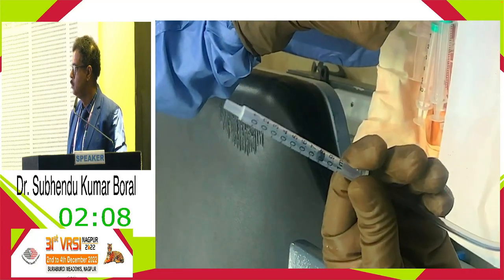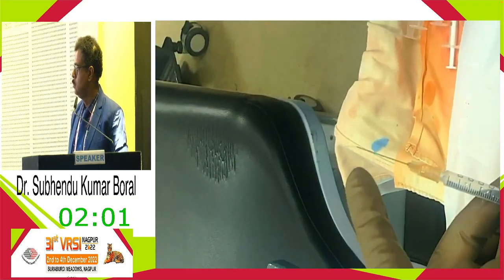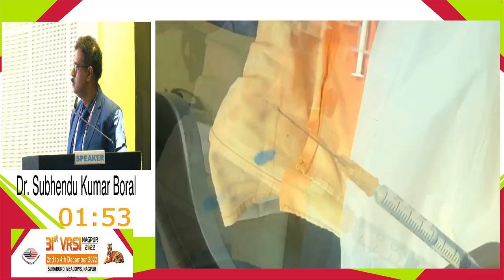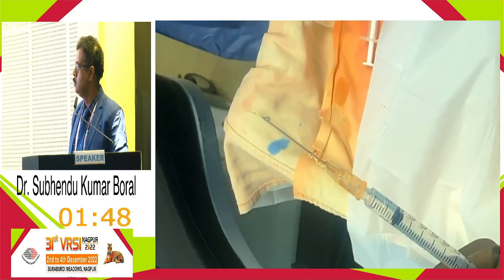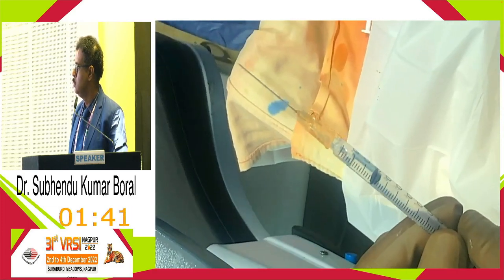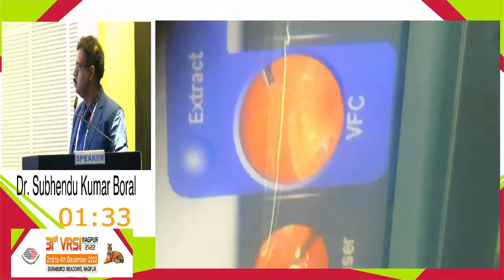Now VFC mode was activated. Attaching either a 38 gauge or 41 gauge subretinal needle to this syringe to extract the retained submacular PFCL bubbles or to deliver a precise dose of subretinal drugs like rTPA for subretinal hematoma in a controlled way. Here the cut rubber tip of the plunger can move smoothly within the 1 ml syringe during injection or extraction mode of the VFC attached with the vitrectomy machine. We named it micro VFC.